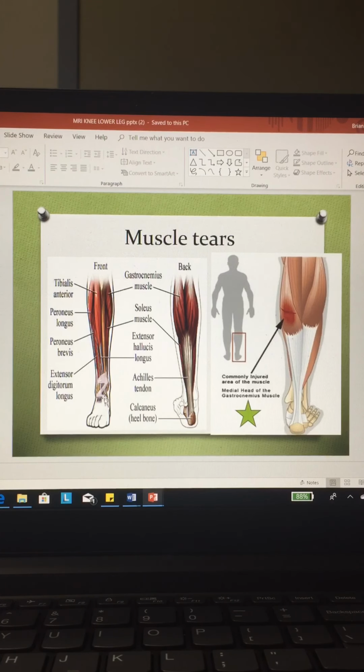In MRI, if we're looking specifically at the bones, we're looking for maybe a stress fracture in the bone. Marathon runners, long distance runners have stress fractures. Stress fractures don't always show up on an x-ray right away. They're still having pain. Well, maybe there's actually a stress fracture in that fibular bone or the tibia bone.